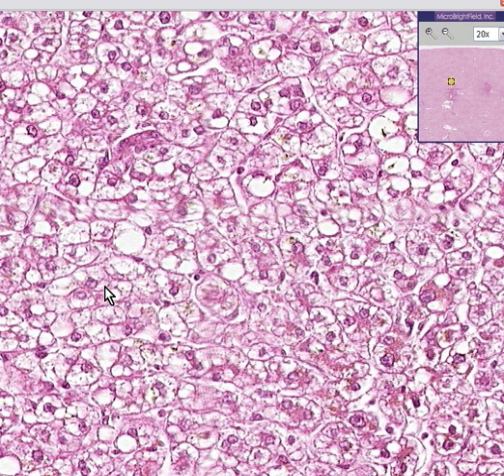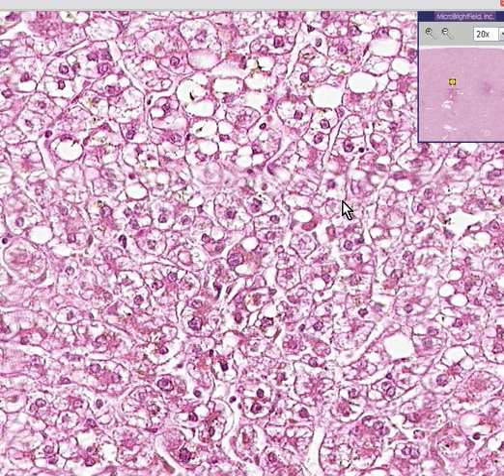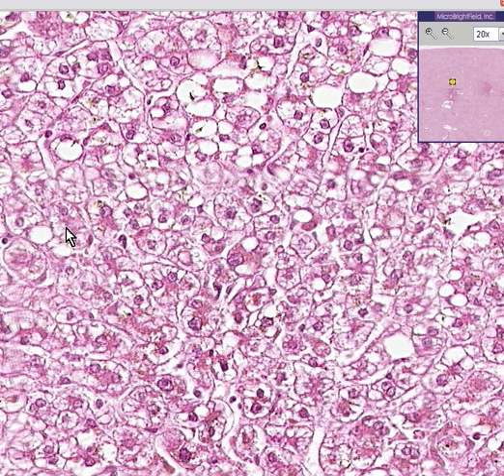Very often fatty livers are divided into microvesicular versus macrovesicular. A microvesicular liver is one in which the fatty spaces are within the hepatocytes — basically all these small little fuzzy areas here — and they are small, so they're called microvesicular.